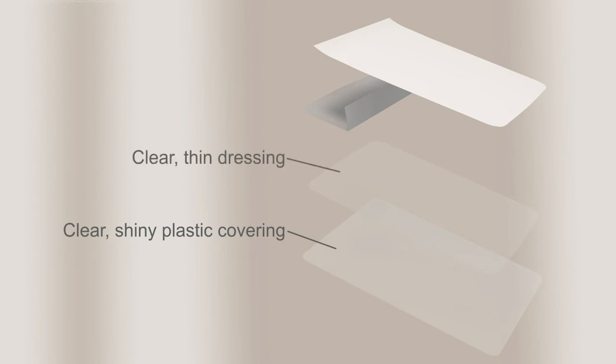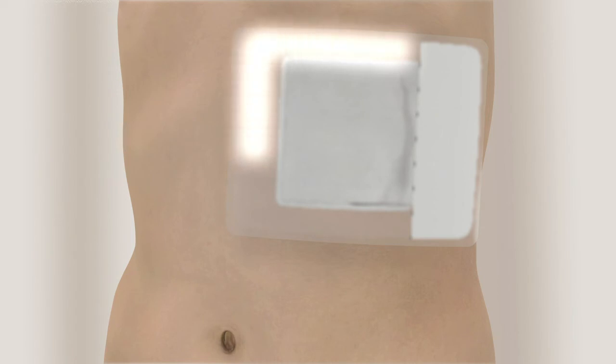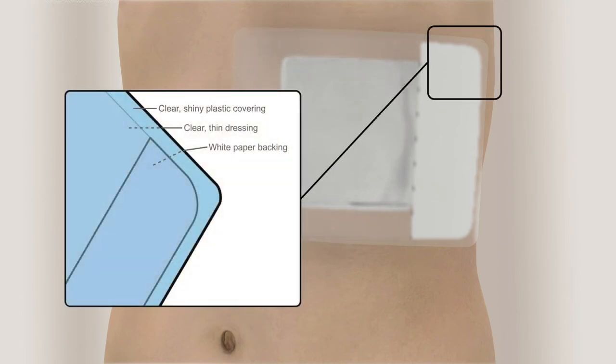The self-adhesive dressing has 3 layers: a clear, shiny plastic covering, a clear, thin dressing, and a 2-piece white paper backing. Remove your gloves before applying the adhesive dressing. Peel the larger of the 2 pieces of paper from the back of the adhesive dressing. Center the dressing over the gauze pads, making sure the adhesive makes contact with the skin all around the foam and gauze pads. Press the dressing down.